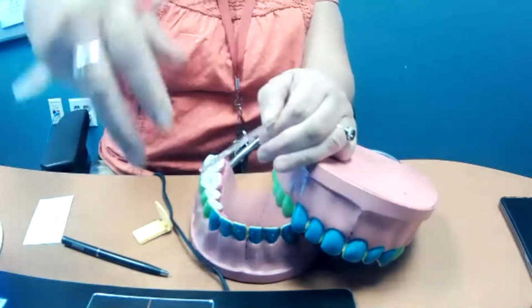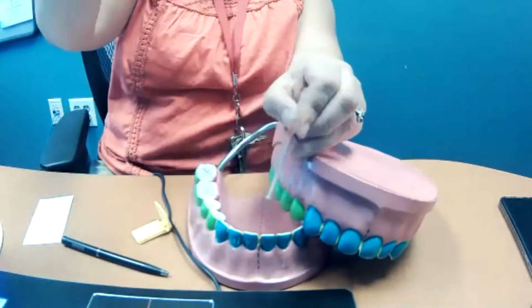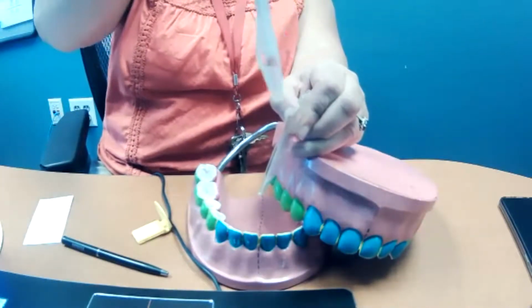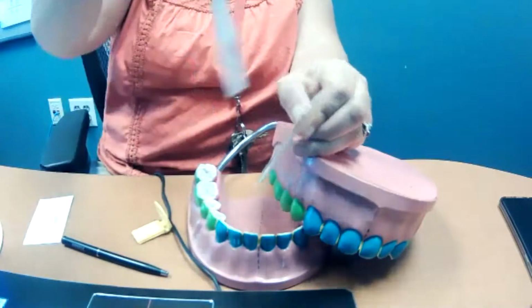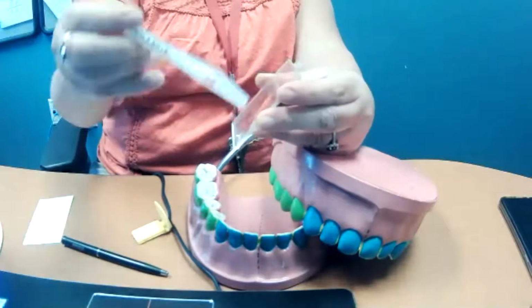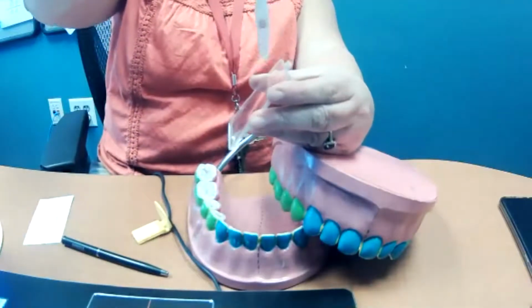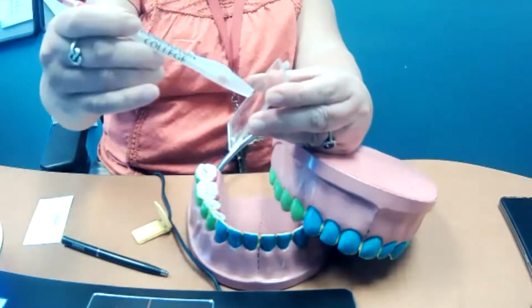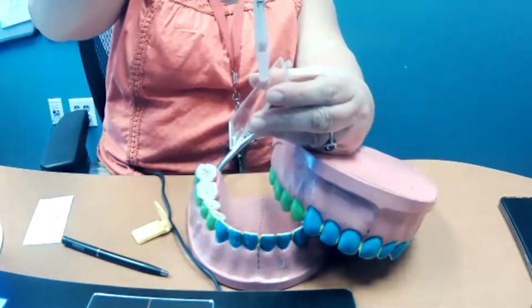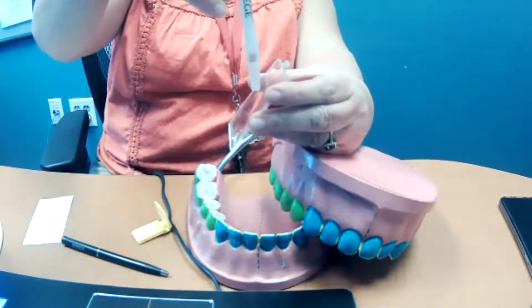If I hold, say this is my person and I hold my camera up here, what does it do to you? It makes you look shorter and wider. So on my film, it's the same thing. If I have a tooth right here, but now I'm shooting from up here, my angulation, I'm not perpendicular, and I have too much angulation, it's going to make my tooth look shorter.